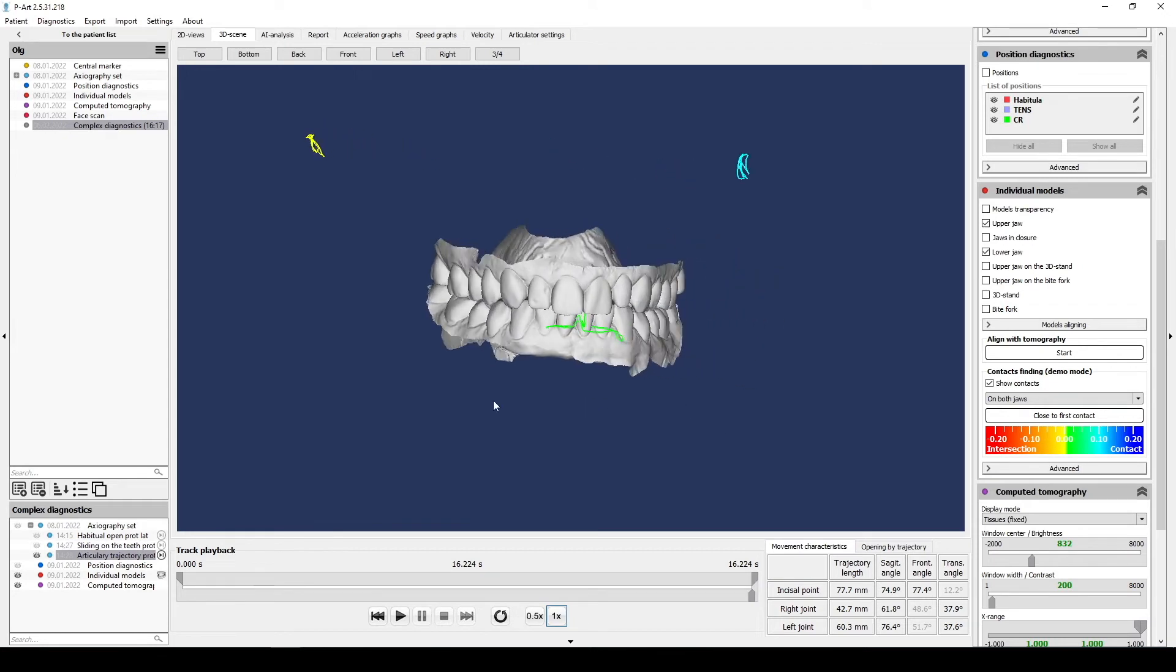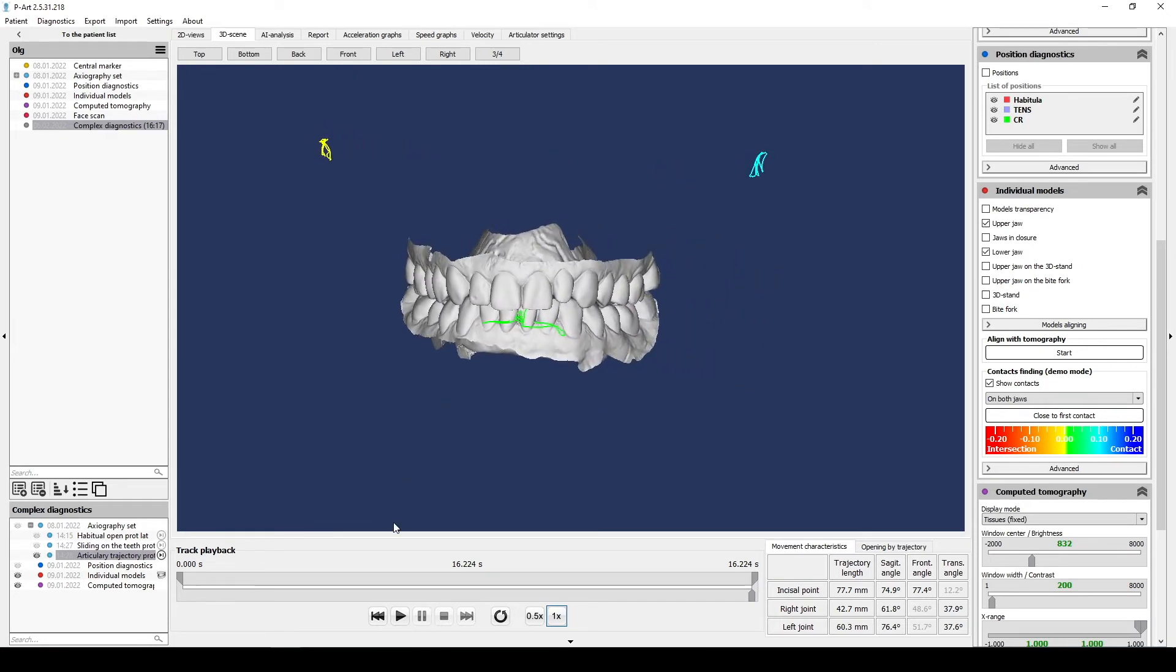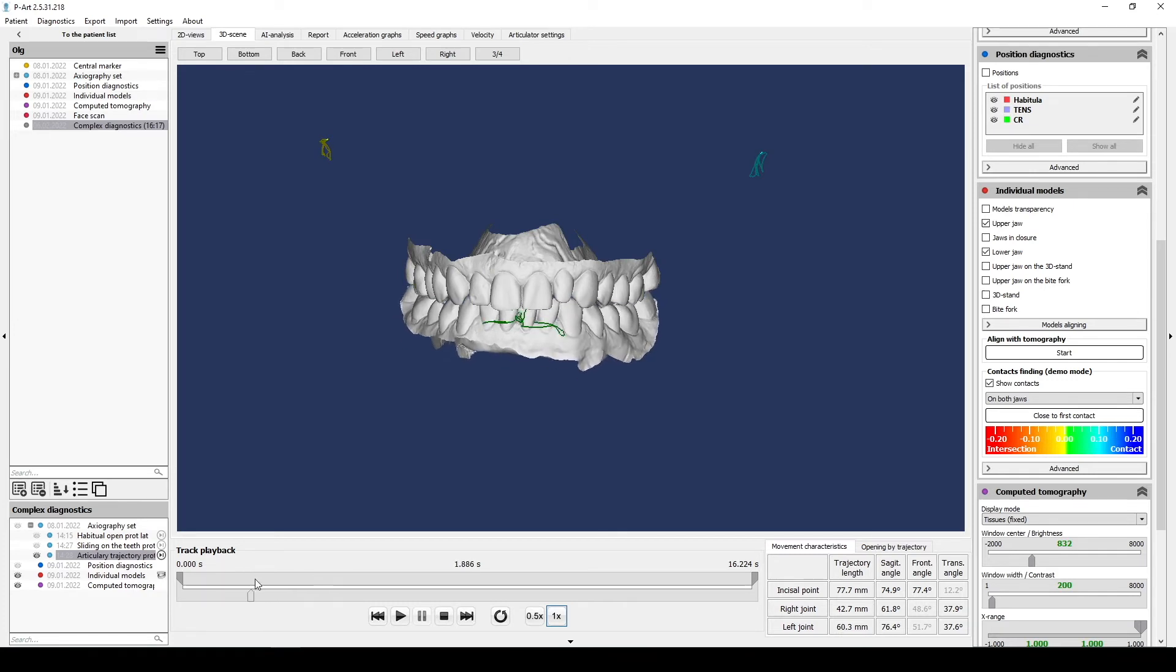Third record. It's also protrusion, left and right lateral trusion, but it is a movement free of tooth contacts.